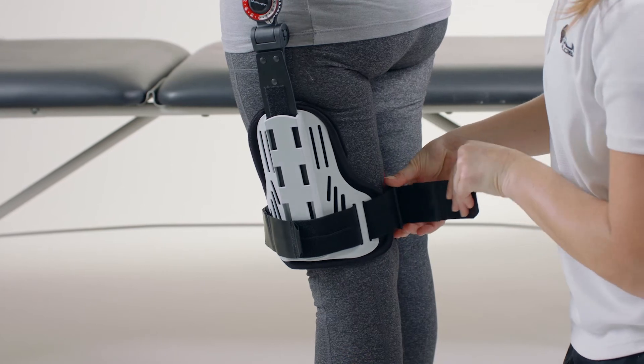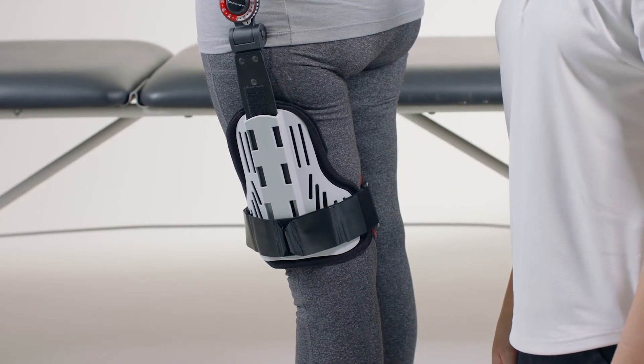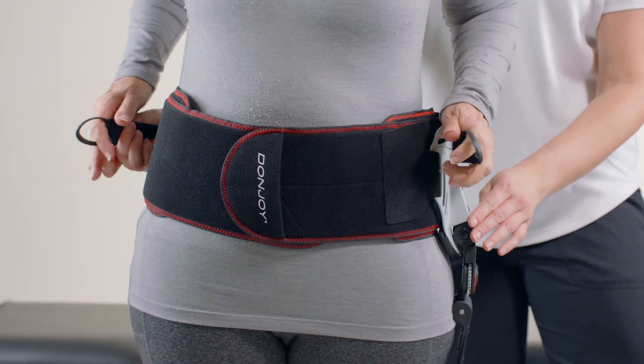Note: to adjust the thigh strap, peel open the shiny tab to expose the strap ends. Cut the strap and reapply the hook tab. Please be careful not to cut the strap too short. Pull the pull tabs around and attach to the front of the waist belt.